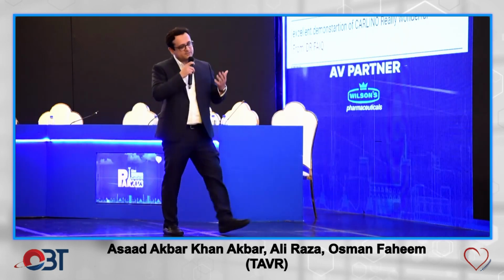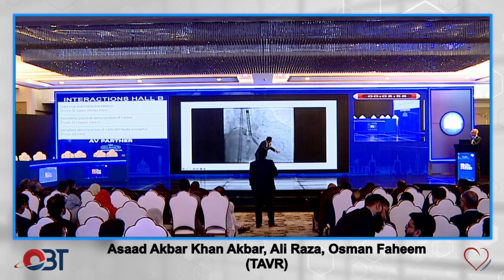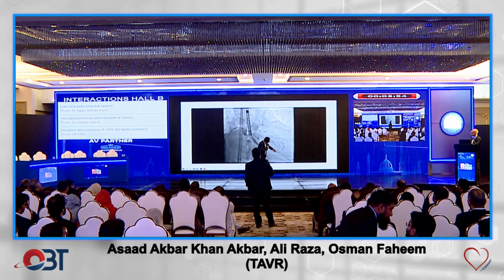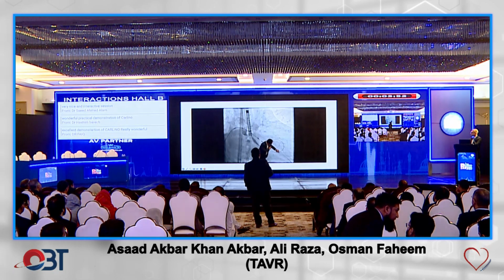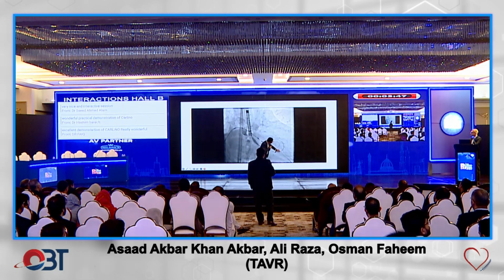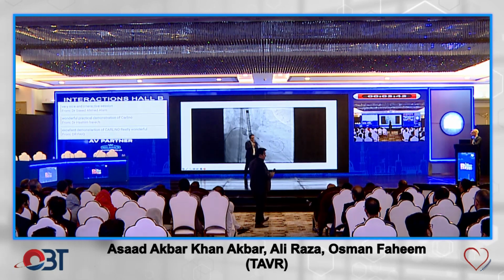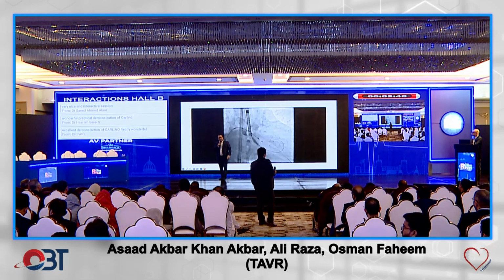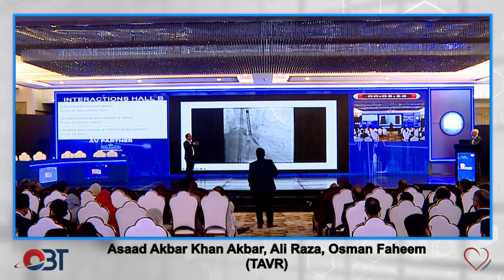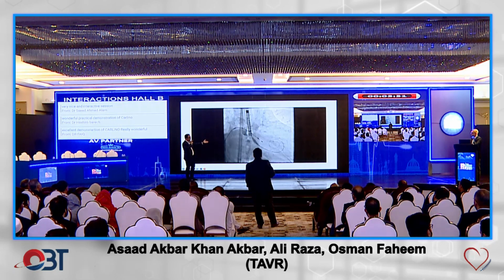Because as we discussed in the training village yesterday, it's this transition of the soft part of the wire and the stiff part. So remember, this part is very stiff, but if you check up till here, it's pretty soft. This junction of the soft and the hard part is the pressure point of this entire delivery system on your LV apex. And if you look at the LV apex in an apical two-chamber view, you'll realize that even if the ventricle is really thick, the apex is pretty thin. So this is the point you really need to control.